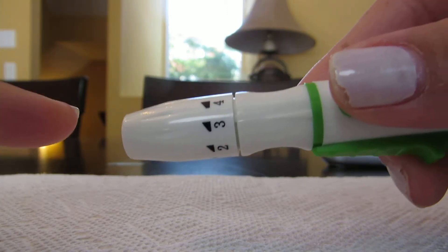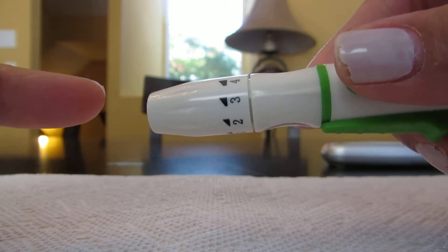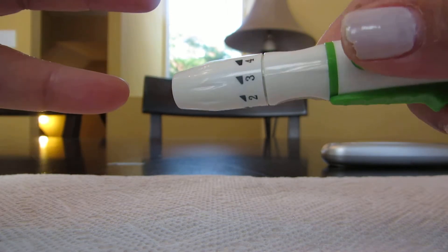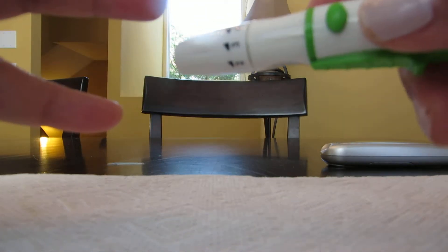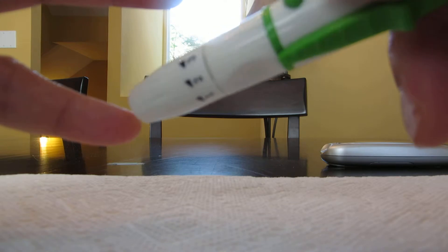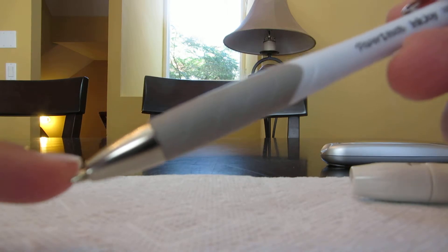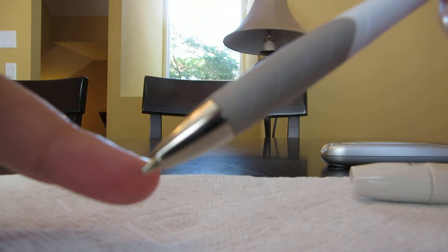You could prick your fingers in many areas. The best way is really on the sides of the fingers—either this side of the pinky, which is popular, or the other side, or the ring finger on the sides.